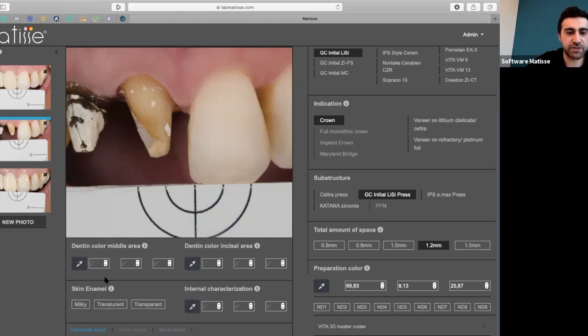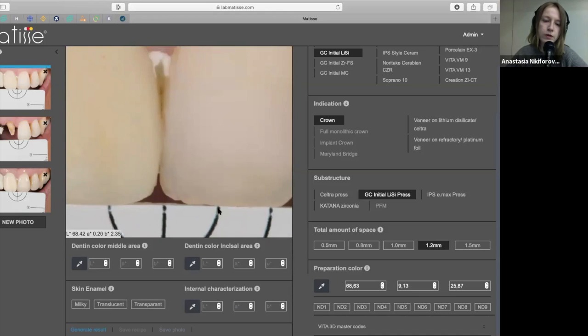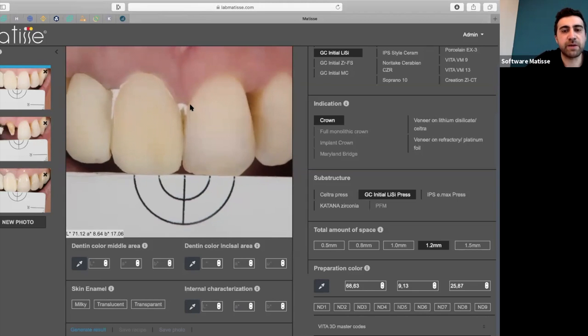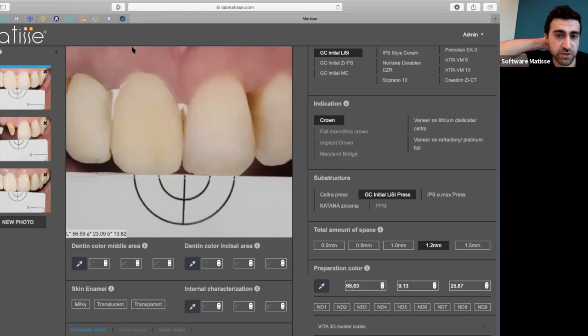Then I have to measure the dentin color middle, dentin color incisal, and if I want, internal characterization. When we are trying to replicate an exact shade, we have to see how many zones the tooth has.